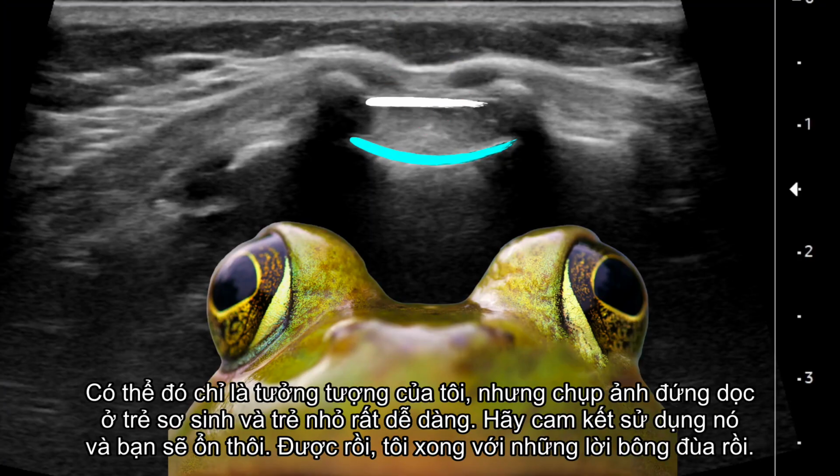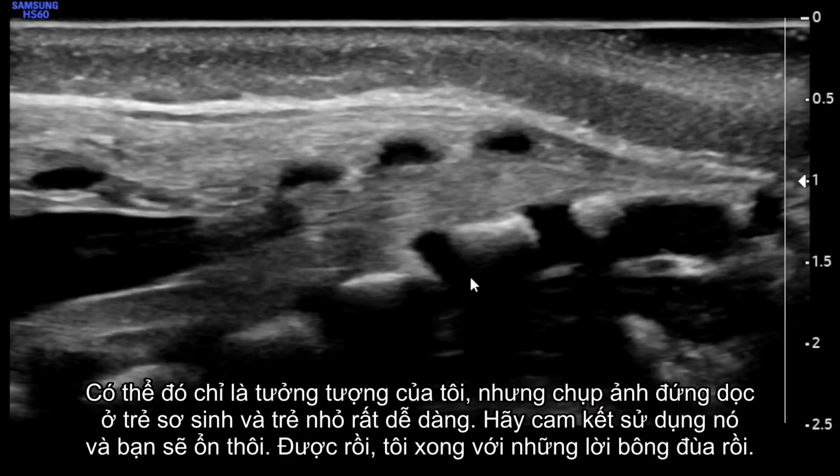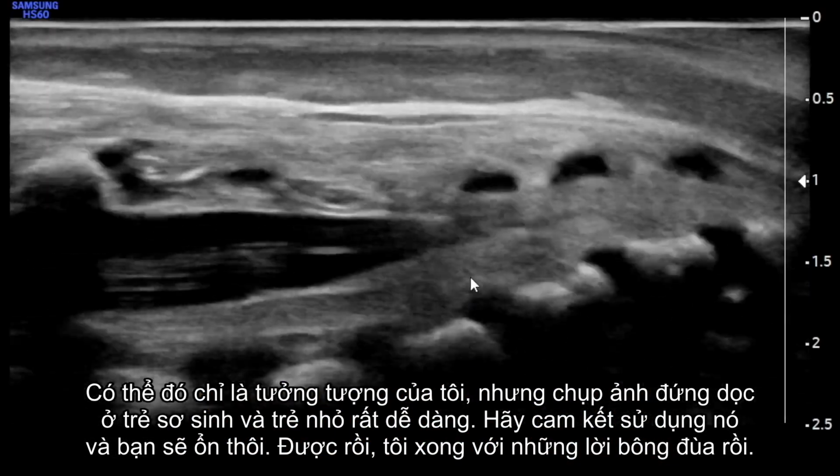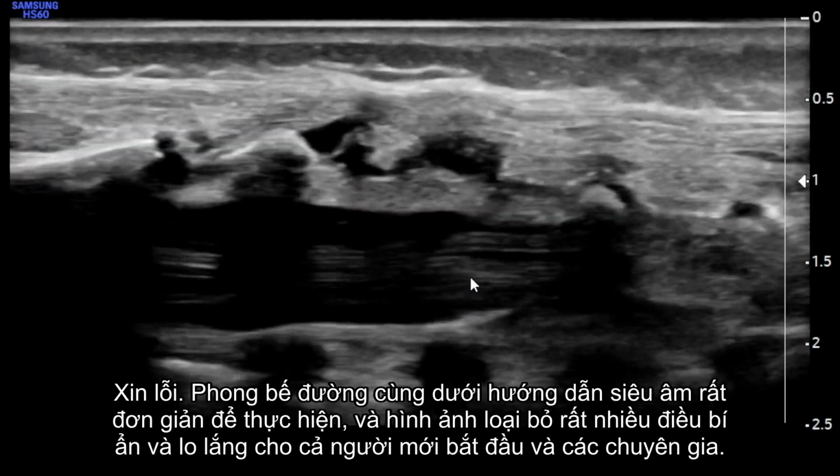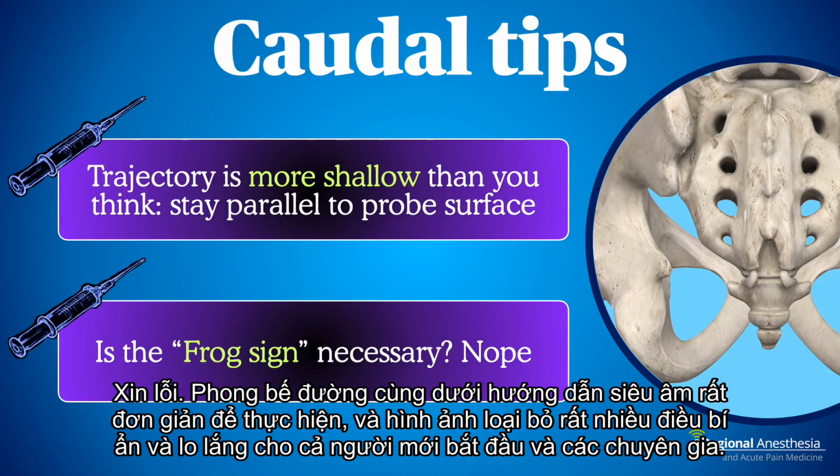It could be a fragment of my imagination, but sagittal imaging in babies and toddlers is easy. Commit to using it, and you'll be fine. Okay, I'm done with the puns. Forgive me. Ultrasound-guided caudal blocks are simple to do, and the imaging removes a lot of the mystery and anxiety for novices and pros alike.